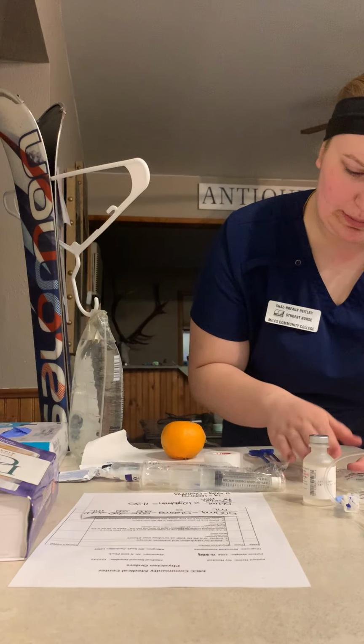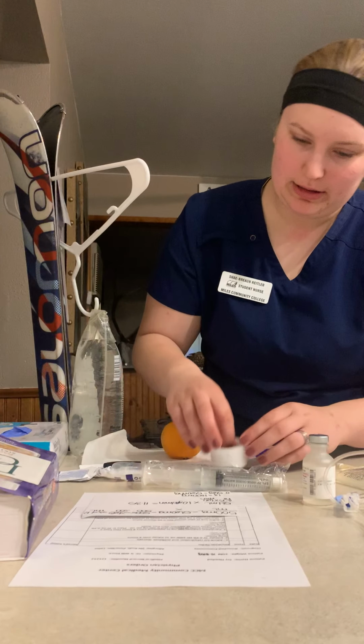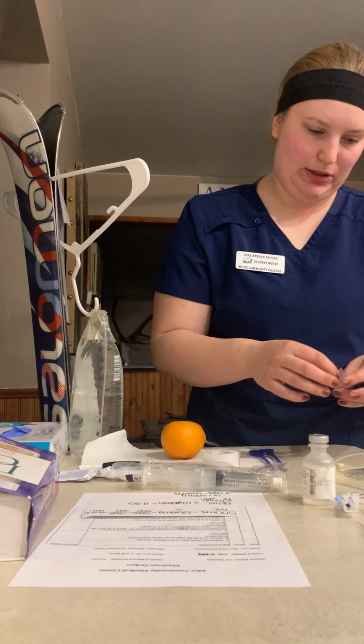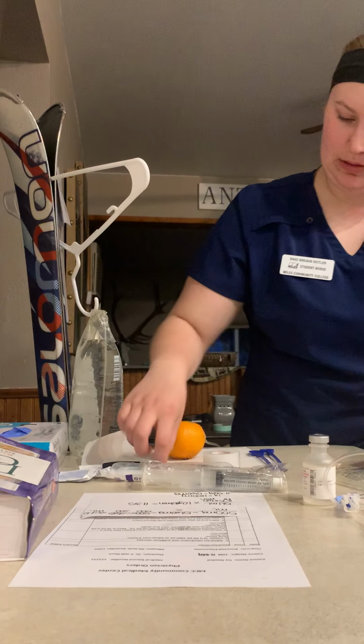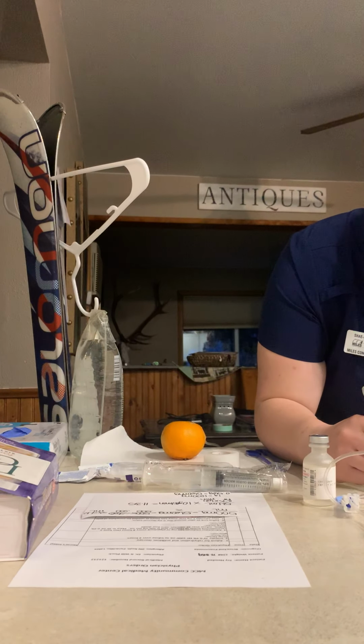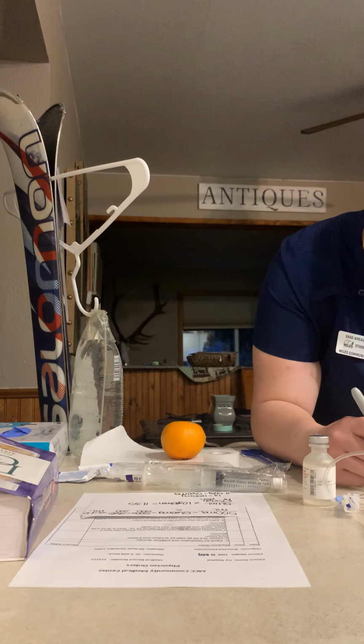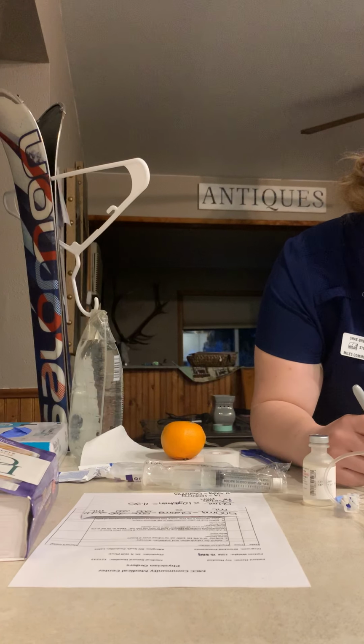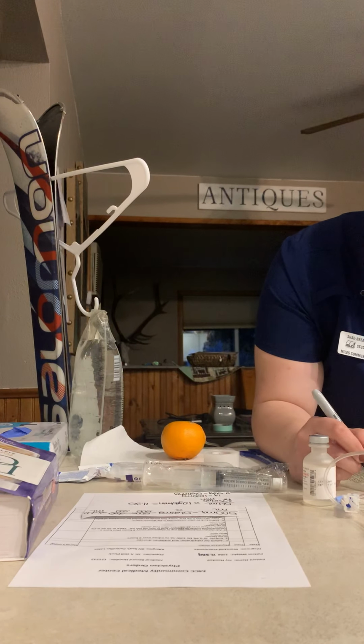And again, just check and make sure you got that sodium chloride, 50 milliliters. And I'm going to label this one. Patient name. Date. Time. Initials.